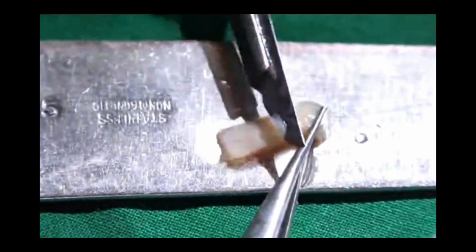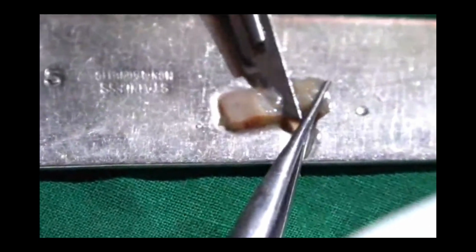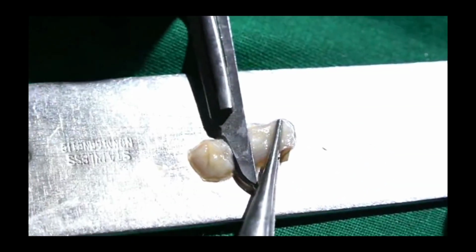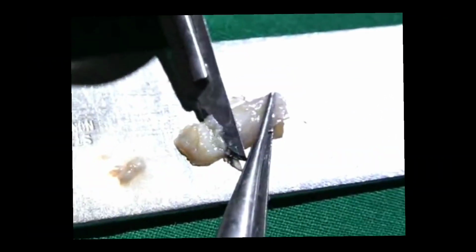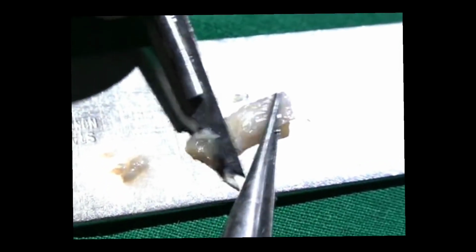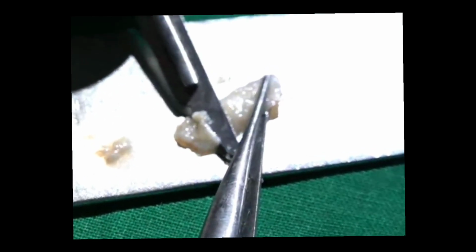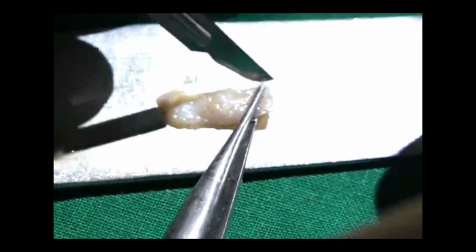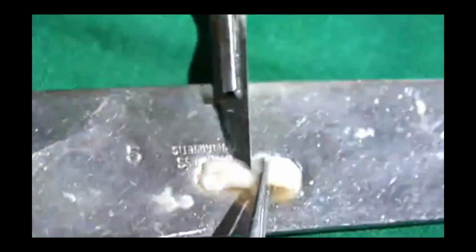graft. For the deepithelialization, we can also do it extraorally using the 15 number blade. One needs to confirm that all the epithelial portion as well as the fatty as well as the glandular tissue is carefully removed to achieve a uniformly thick connective tissue graft for the insertion into the tunnel that is prepared.